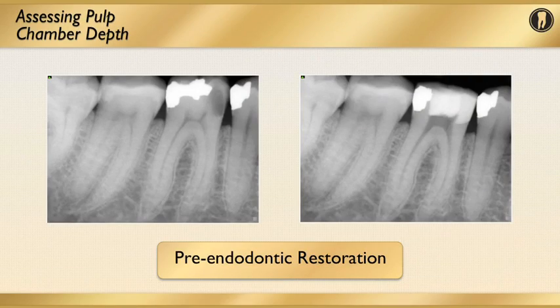And again, to reiterate, preoperative restoration of the tooth is crucial, not only for maintenance of our chemicals of disinfection, but also in providing a seal that will provide us with the ability to aseptically provide a restoration that will not allow recontamination of the case that we work so hard to prepare and to decontaminate. The radiograph on the left demonstrates the mesial carious lesion of number 30.